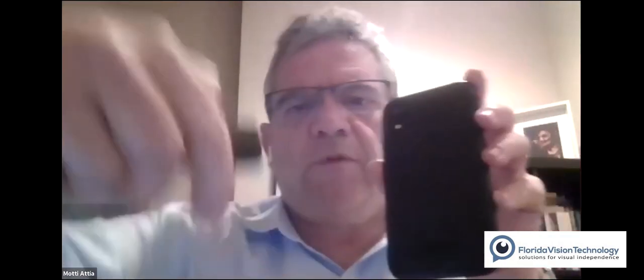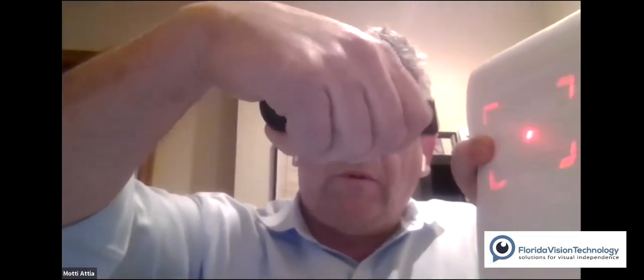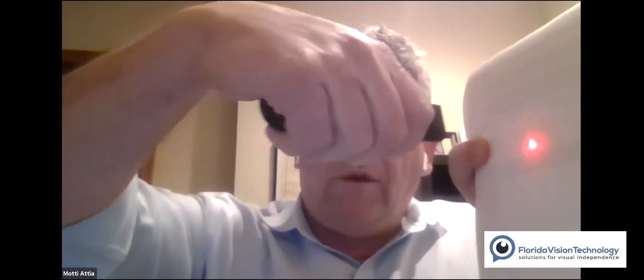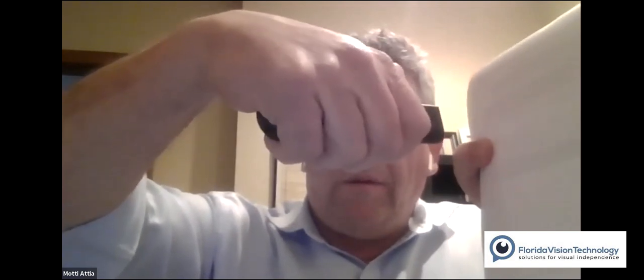So just to help you, Michelle, I'm going to use my cell phone a little bit. Thank you, Moti. This is the cursor. If you see the cursor, I'll take a page here. This is the bounding box, okay? Correct. Double click, I move to the cursor. Okay, again. Double click, bounding box, double click, cursor. Thank you. Go ahead.